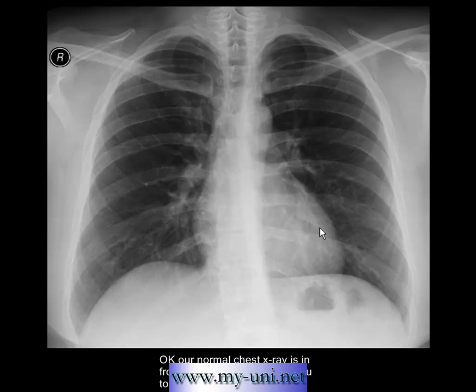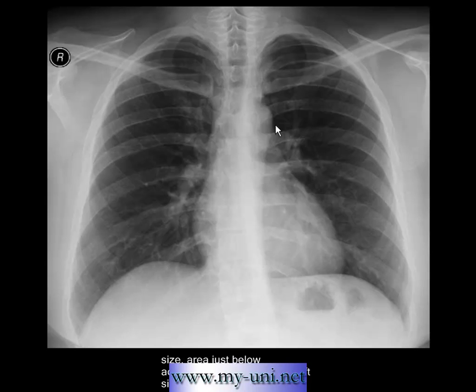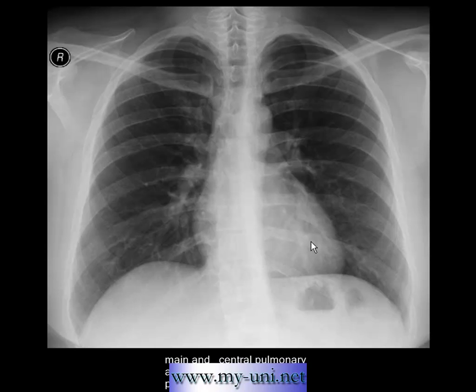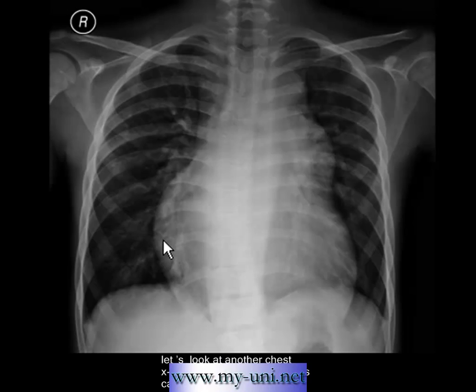We have a normal chest X-ray in front of us. I want you to pay attention to cardiac size, the area just below the aortopulmonary window on the left side, and also the size of the main and central pulmonary arteries. The term 'central pulmonary arteries' refers to the right and left pulmonary arteries and their immediate branches.